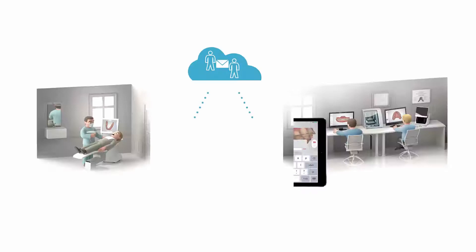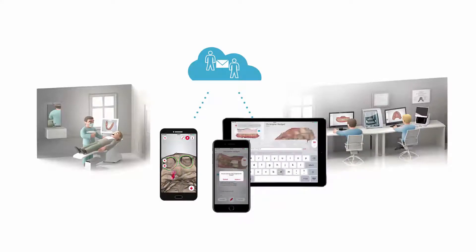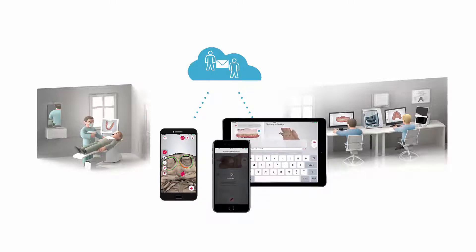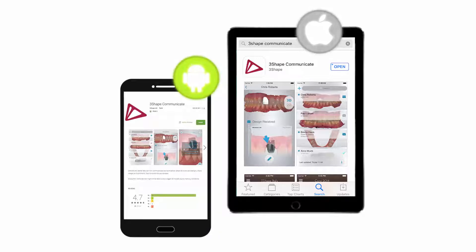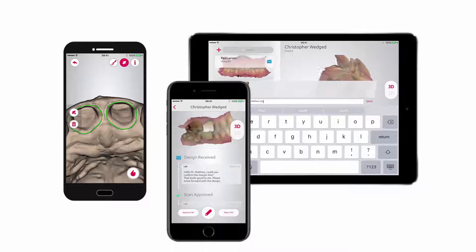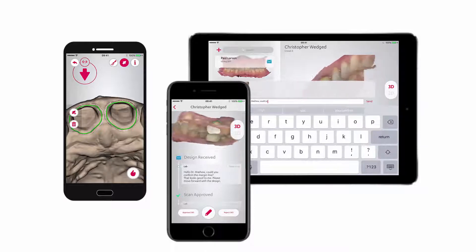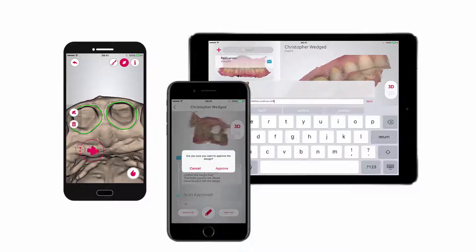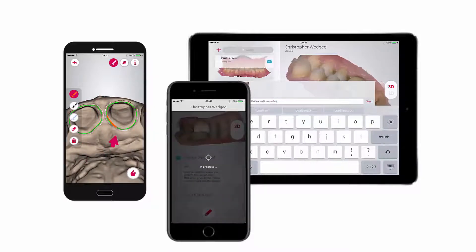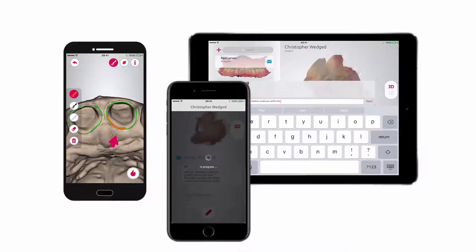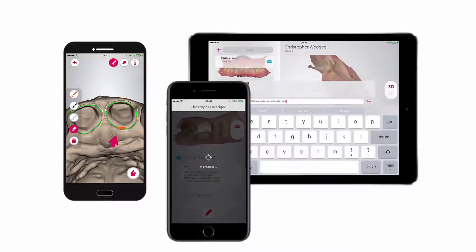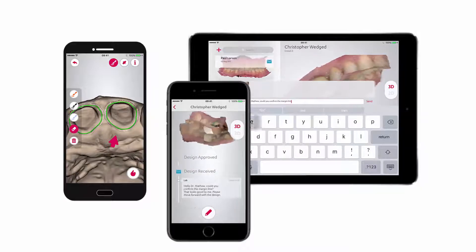Welcome to our series about 3Shape Communicate. In this video you will learn how the communication between a dentist and a lab via the 3Shape Communicate mobile application works. The app can be installed on mobile devices running iOS or Android. It enables not only the viewing of cases but also active communication between a dentist and a lab, based on a situation where the dentist sends a case to a technician for design and production, all via the app on a mobile device like an iPhone or iPad.